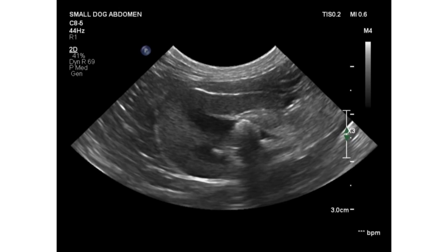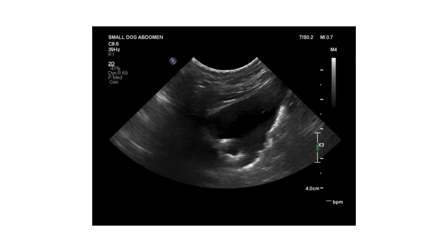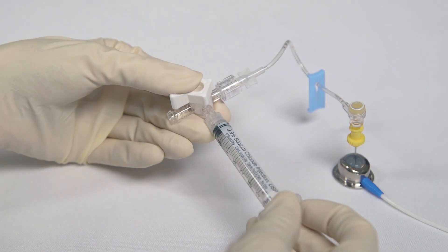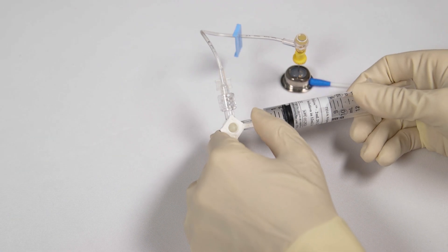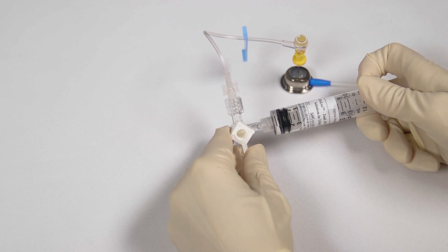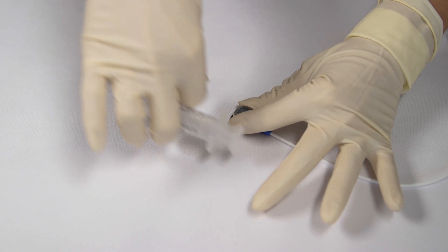Bubbles may be seen as the saline is instilled. The process is repeated whilst the urinary bladder is visualised. Movement of saline or urinary sediment during flushing indicates a patent cystostomy catheter. The saline is withdrawn back into the syringe and discarded. The tetrasodium EDTA T-flow lock solution is attached to the three-way tap and one to two millilitres is instilled into the SUB device. Holding the port steady, the Huber needle and associated consumables are withdrawn from the port and discarded.